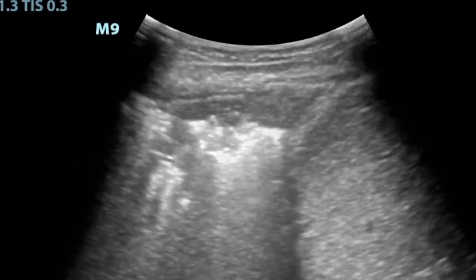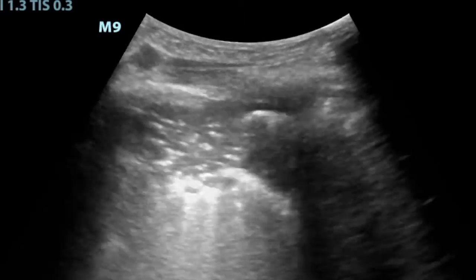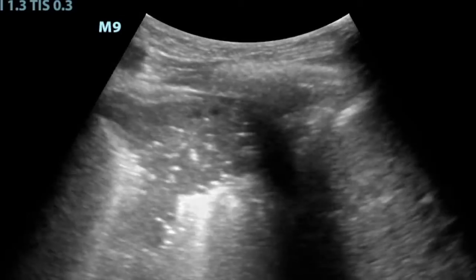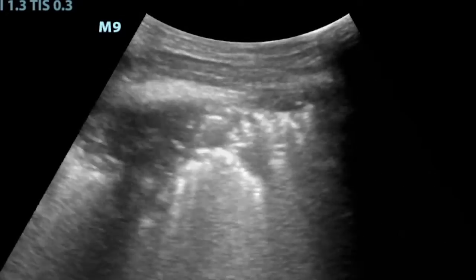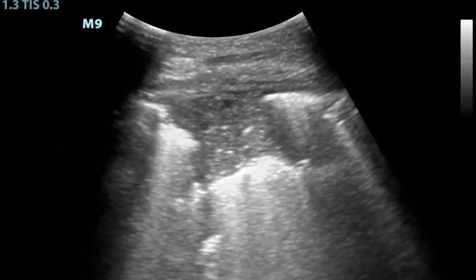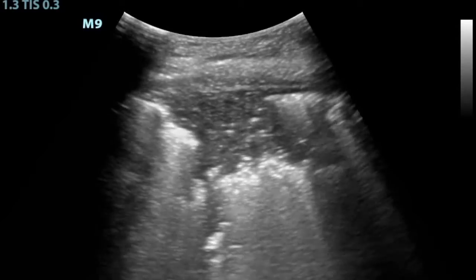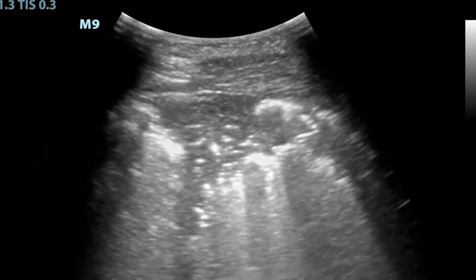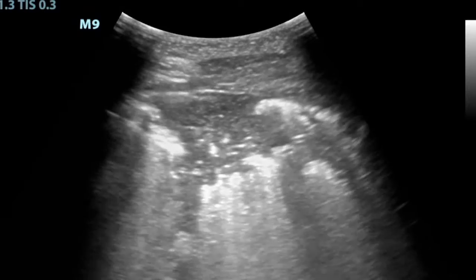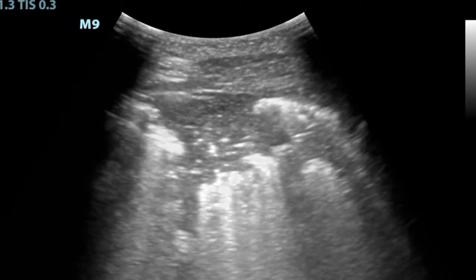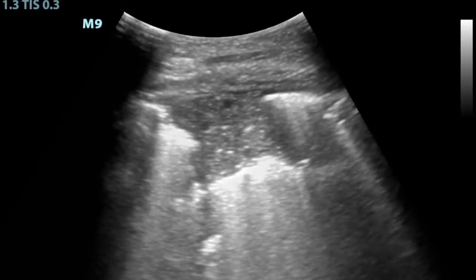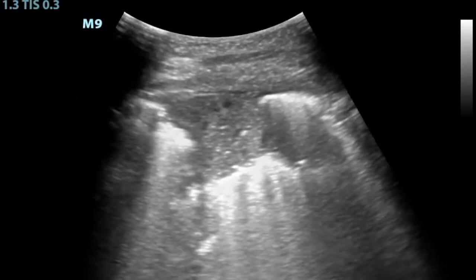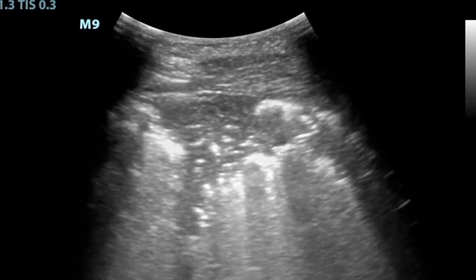So how did Kovar differentiate a consolidation from atelectasis? He held the probe still, watched the patient breathe, and captured these clips of moving or dynamic air bronchograms. These are produced by a column of air moving through a consolidated lung and indicate liquid rather than collapsed alveoli. In other words, he was able to diagnose the patient's pneumonia.